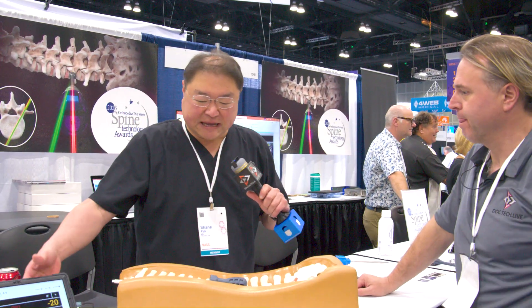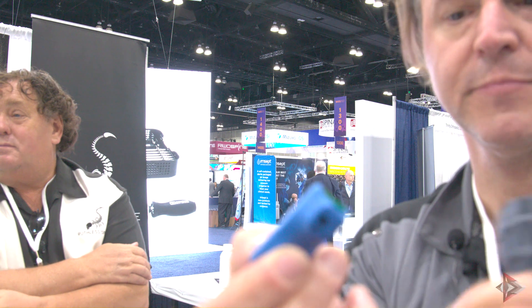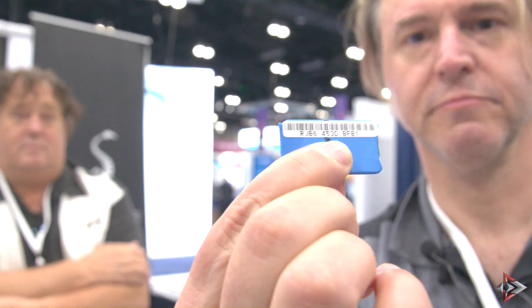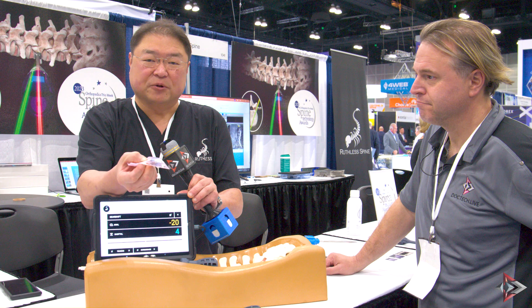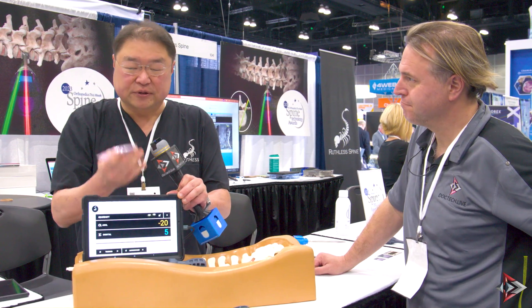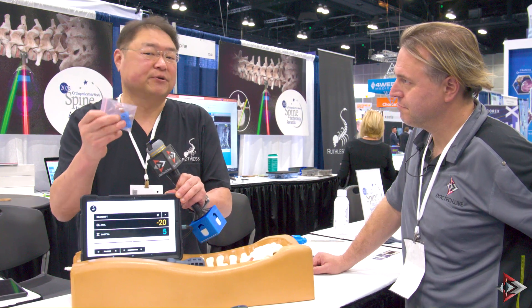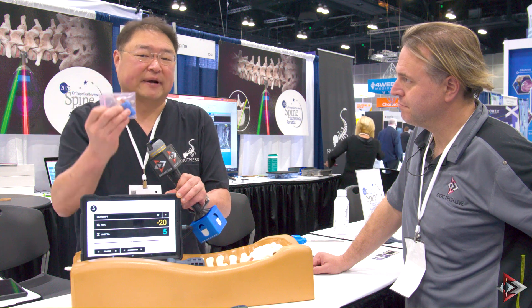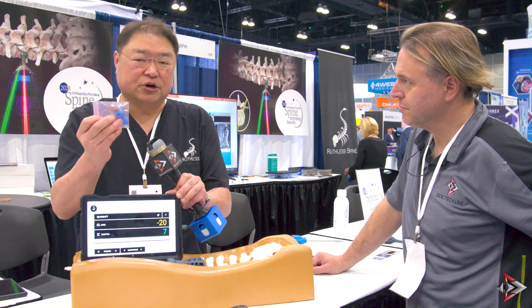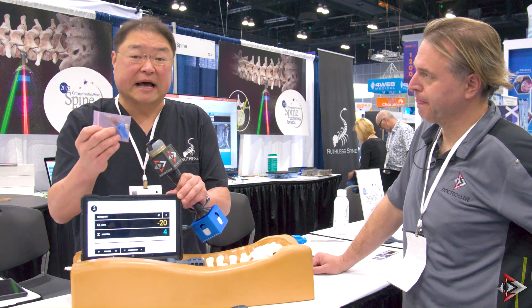Welcome. This is the RJB, a single-use disposable navigation system. Unlike every other navigation system on the market, this is the entire system — the Android tablet and single-use disposable modules. You open up the sterile peel pack, yank out the battery tab, and it will connect wirelessly via Bluetooth to your Android tablet. It uses a sensor similar to the sensor in your phone that tells you whether the phone is upright or on its side. This is mature technology that has been used countlessly for a decade and you can rely on.